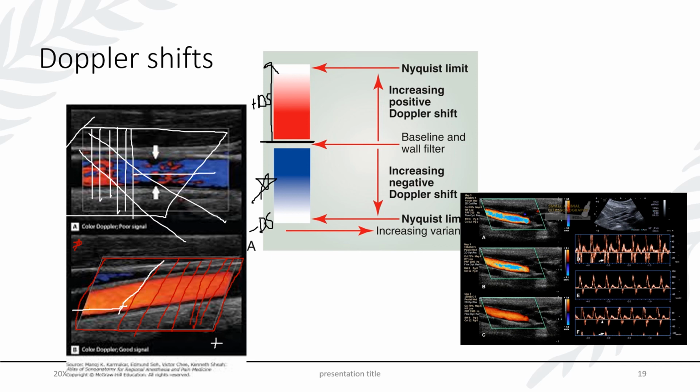This can become very important if you're looking at the carotid area, and some patients that develop a subclavian steal will develop retrograde flow in the vertebral artery. It's really important that we don't just put color on an artery and assume that the blood flow, say in the vertebral, is going towards the head. We always need to take all of the hints and clues to make sure that it truly is going the direction that we're expecting it to.